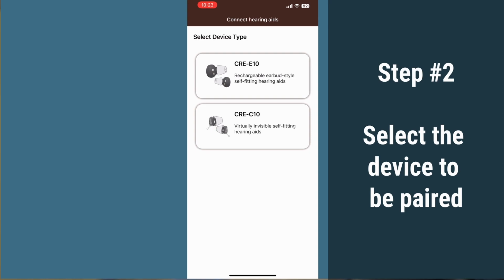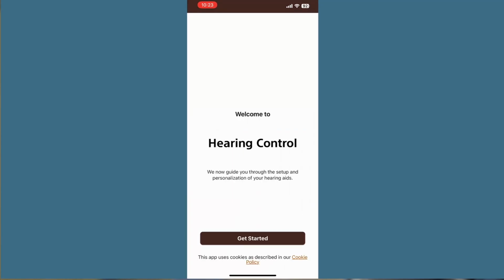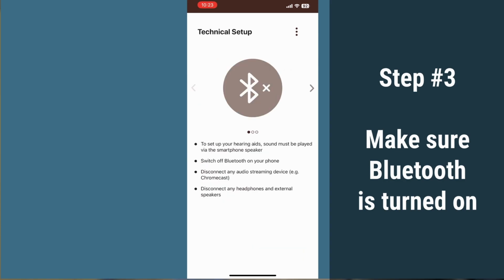First thing you do is obviously establish an account with Sony. If you already have one, log in. Then you're going to select which device you're trying to pair. It is important to note that these hearing aids do connect to the app via Bluetooth.